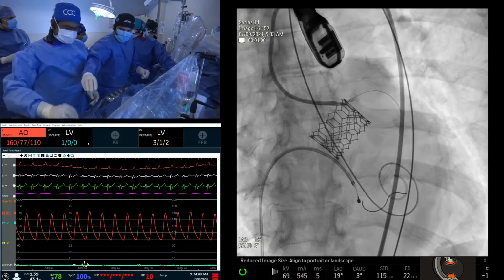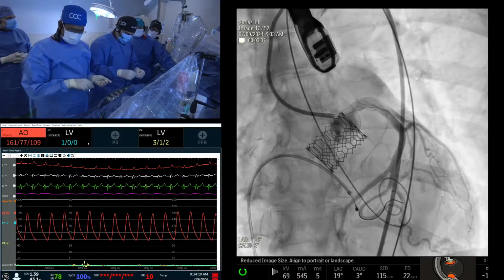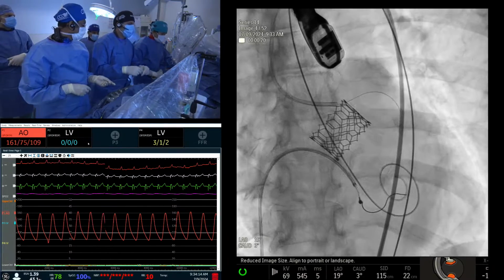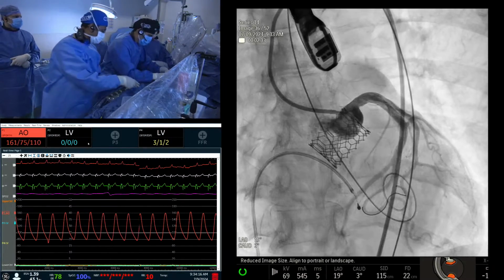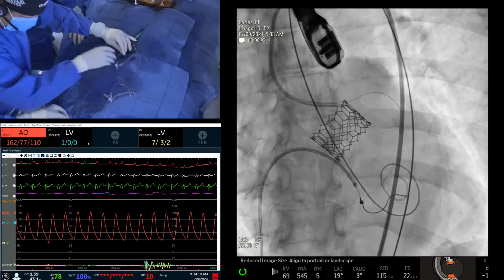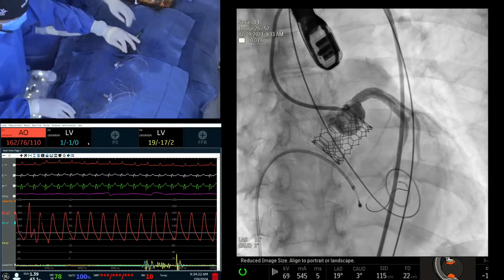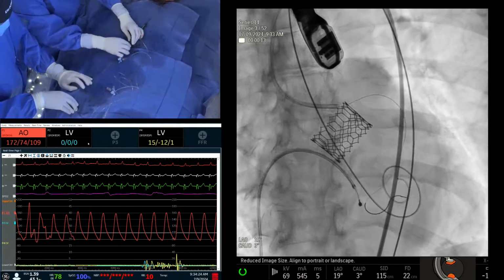Make sure you floss it. Good idea. Just in case we need it, but don't leave it there. I don't think you need to do that. Okay? I agree with AK, because everything changes once you place the second valve. I know. But we want to make sure that we are metal to metal in the cell, good, no resistance. Nothing.